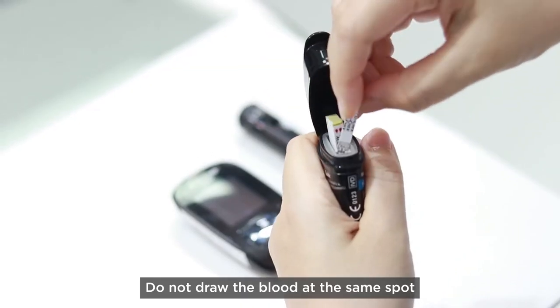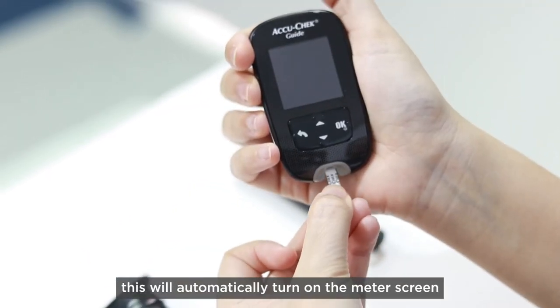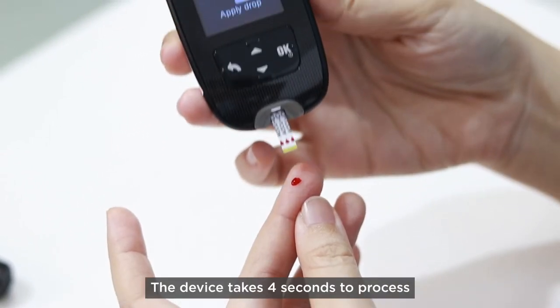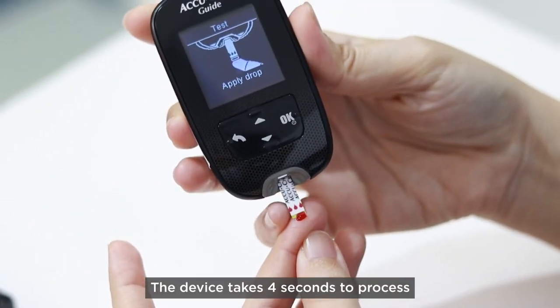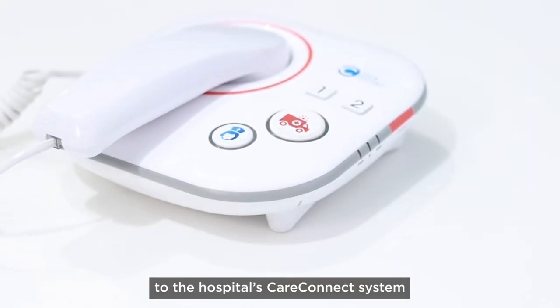Do not draw blood at the same spot. Place the test strip in the meter, which will automatically turn on the meter screen. Touch the end of the test strip to the drop of blood. The device takes 4 seconds to process and the results will be automatically transmitted to the hospital's CareConnect system.